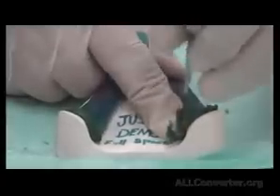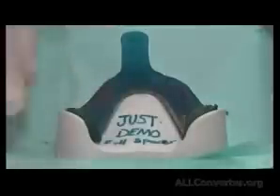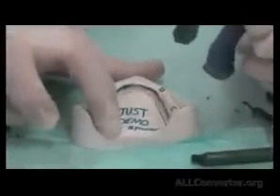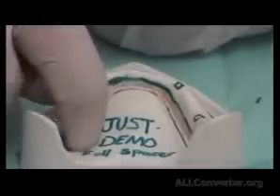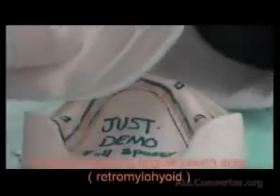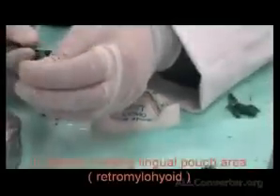Now we're reaching the lingual pouch area. The lingual pouch area is a special area in the lower. It is the area on the distal end of the ridge, and if the tongue was here, it will be on the distal or the base of the tongue area. It's close to the base of the tongue. This area is deep. It's deeper than the buccal. And it is the main area that provides retention for the denture. So we need to record it well. So we're going to add in the same manner, but the instructions to the patients are different.